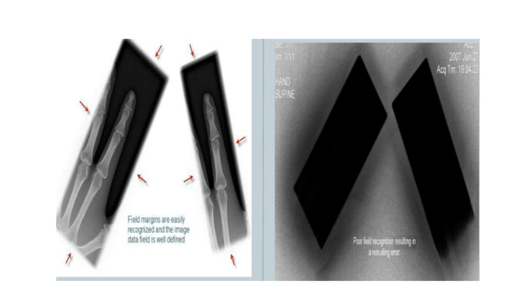And maybe that's because they were diagonal. Could be a lot of different reasons. Here it figured it out and everything's okay. This can easily happen when you do bilateral hands and you do them both at the same time. I know you're trying to save radiation, but maybe you can cause a problem in CR/DR when you do that.